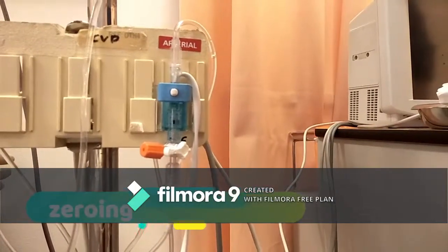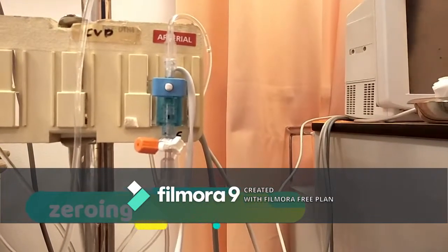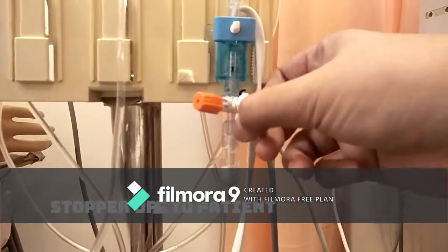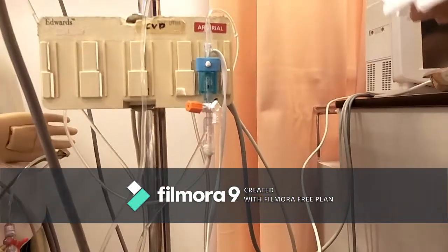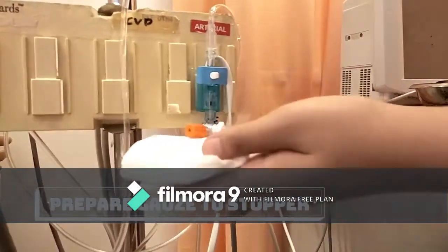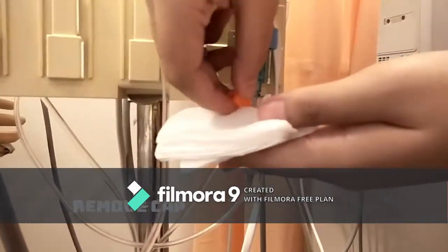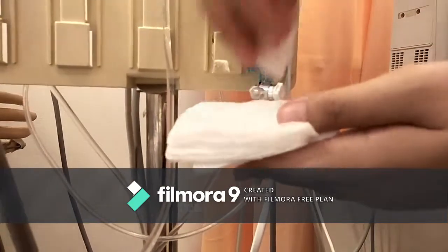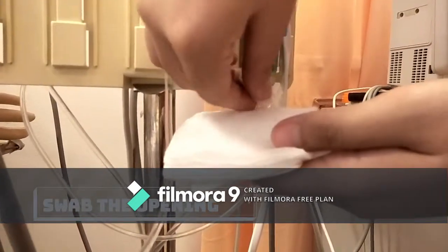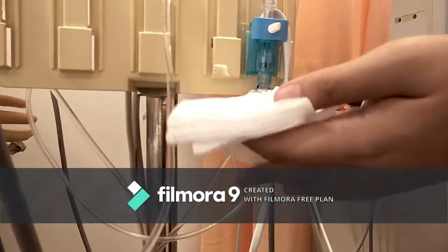Now, for the zeroing procedure, first turn the stopcock off to the patient. Then, prepare the gauze at the stopper and then remove the cap. Get an alcohol swab to swab the surrounding of the tube.